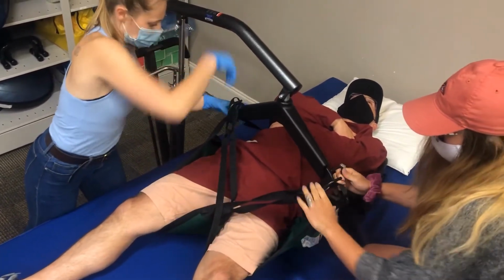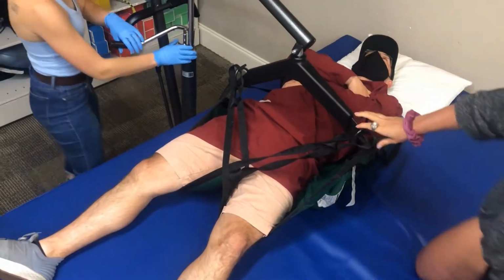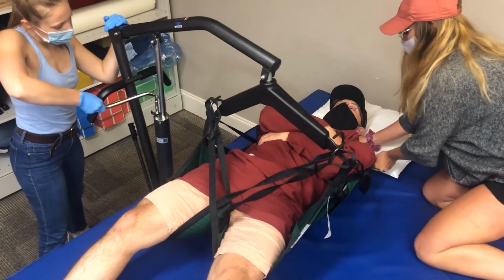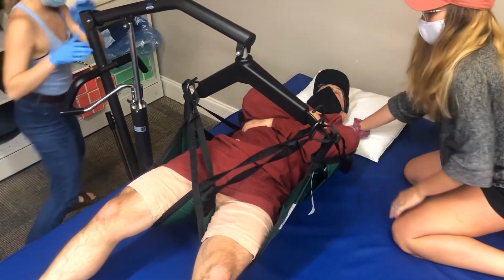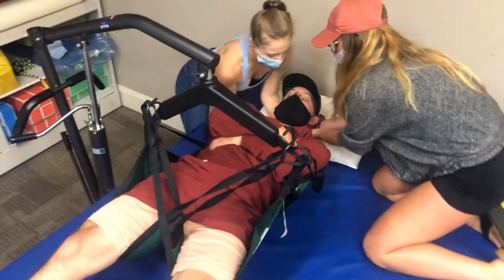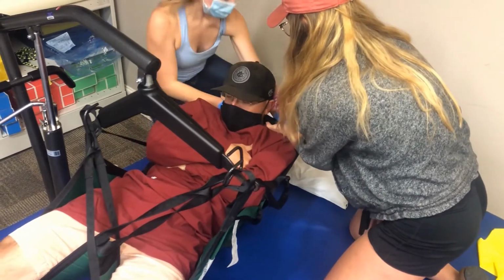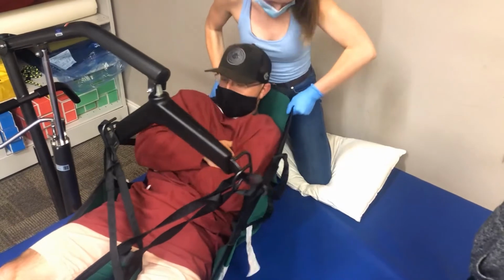The Hoyer offers multiple loops, so choose the one that best fits your loved one. Make sure the Hoyer handle is locked so that when you try to raise your loved one, it does not continuously fall. You may have to adjust the sling to ensure your loved one's head is supported by the sling. To do this, just grab a hold of the sling and pull upward until it supports their head.